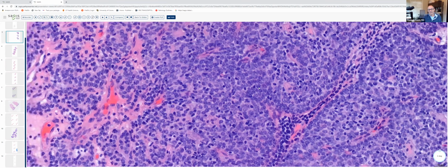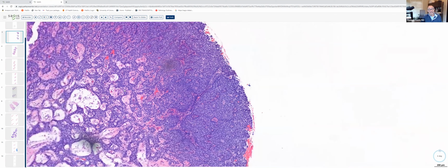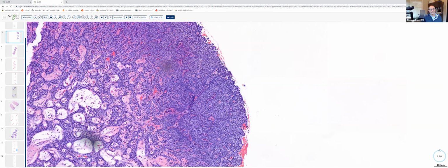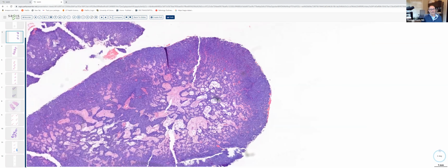And this constellation of findings, the overall configuration, blue balls in the dermis, two cell types, light and dark staining, and a sprinkling of lymphocytes in concert with ducts in the tumor and an edematous stroma are diagnostic of spiradenoma. And of course, this is one of the glandular neoplasms that shows differentiation towards the secretory component of the sweat gland. So very nice example here of a spiradenoma.